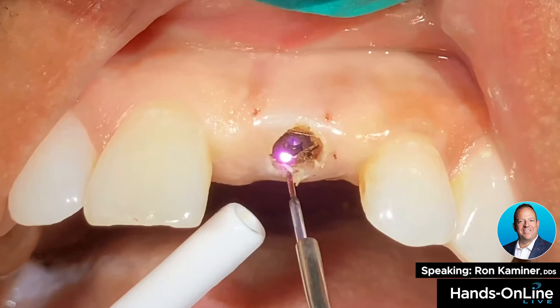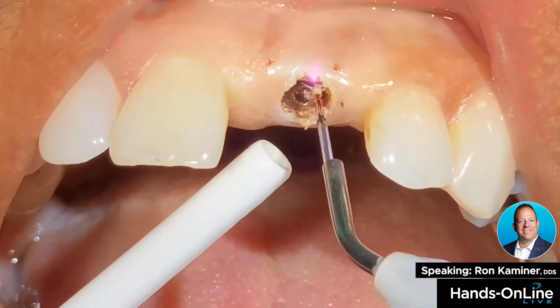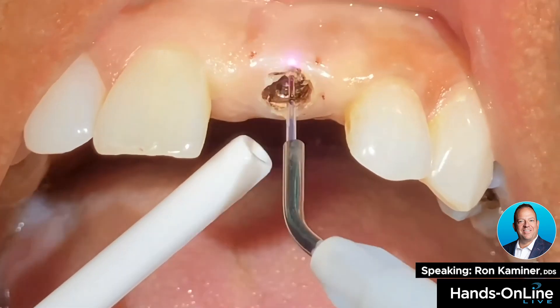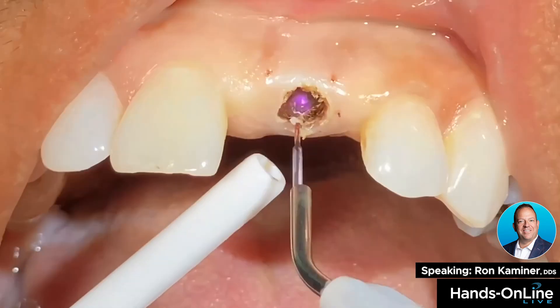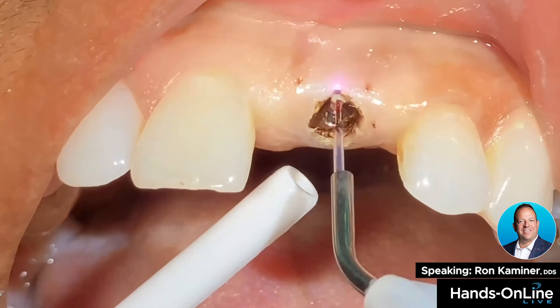We want to make sure to outline the entire healing abutment so we can easily unscrew it when we have to. Once it's unscrewed, I can totally go back in if I want to and refine any internal tissue that could be in here.